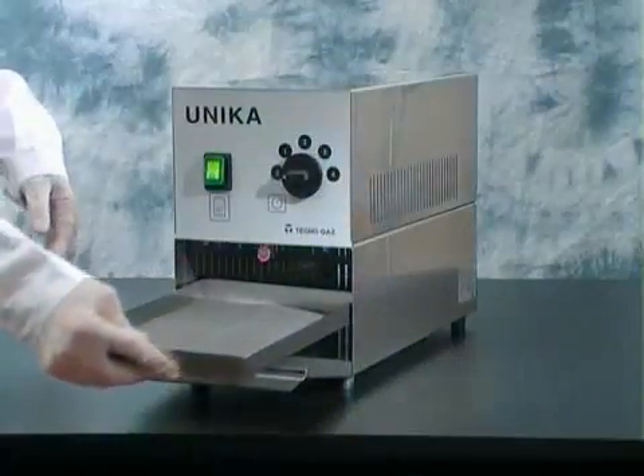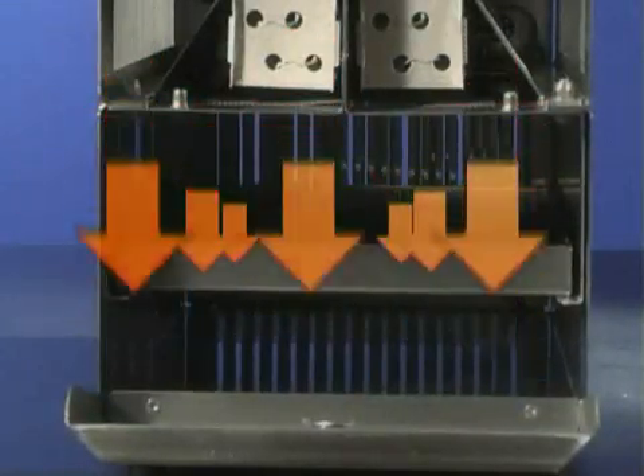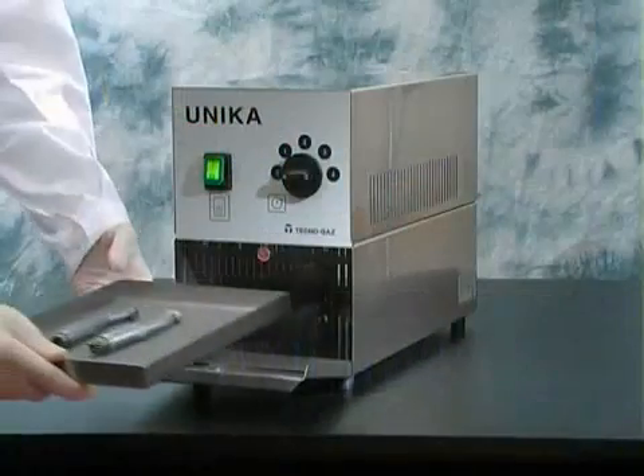It has a chamber into which a tray containing the equipment to be dried is inserted. The door is then closed and the timer set. An internal convector system ensures drying in approximately 2 minutes without the need to intervene manually.